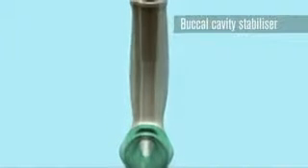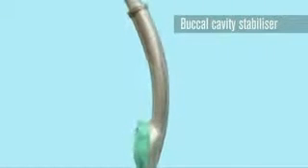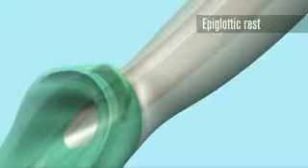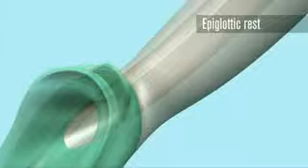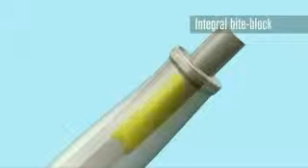The buccal cavity stabilizer eliminates the potential for rotation and aids insertion. An epiglottic rest helps to prevent the epiglottis from down folding or obstructing the distal opening of the airway. The 15mm connector extends inside the airway tube far enough to provide an integral bite block.